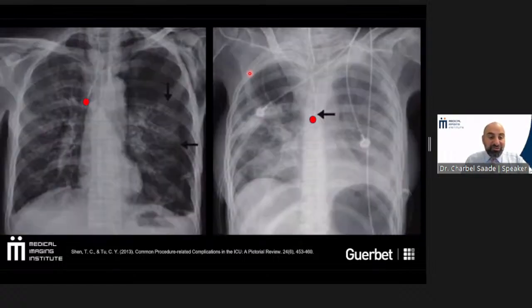Here, they've put in a central line, but look what's happened. It's too high up and they've caused a pneumothorax. Okay, again, here is another one. They've come in from the top all the way down and it's too high up. So again, if I look at the coronal, it's right here, 42% chance of thrombus. This is going to be a high risk patient.